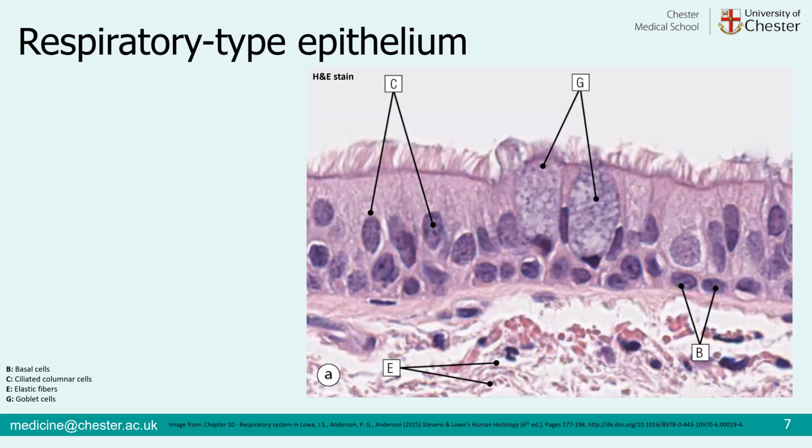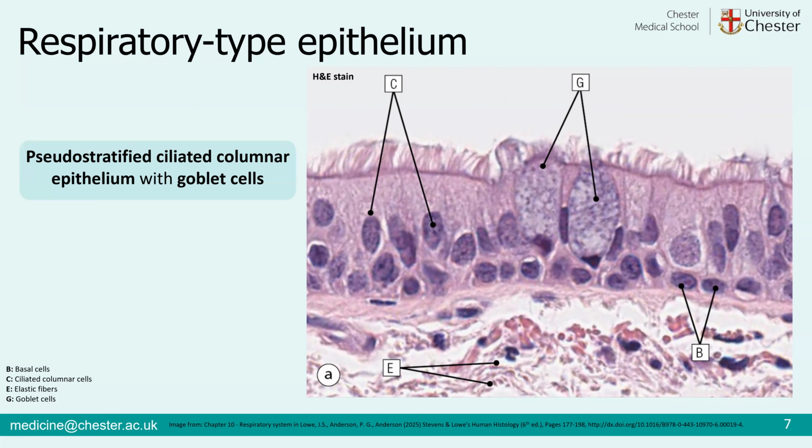As I said, we're going to see featured very heavily today a particular type of epithelium that is pseudostratified. So not throughout the entire respiratory system, but for a large portion of basically our nasal cavity down to our bronchioles, we see what's typically called a respiratory type epithelium. Now that name doesn't tell us a lot about what type of epithelium it is. It's actually a pseudostratified ciliated columnar epithelium with goblet cells. So you can see why people abbreviate it just to say respiratory type epithelium.